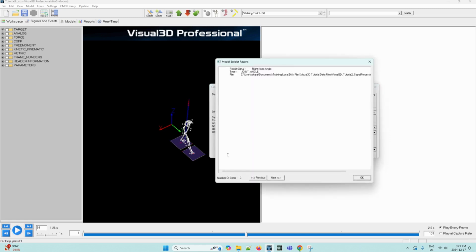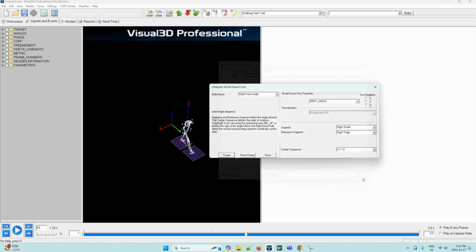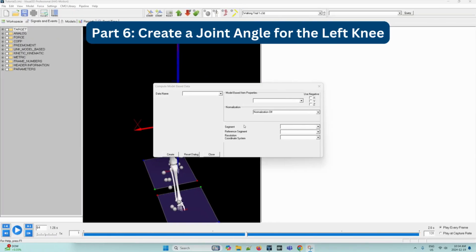The joint angle is created and a processing dialog shows if any errors were encountered. This dialog also contains which files were processed, which is important to note because signals are only created for active files. Now we can press OK.